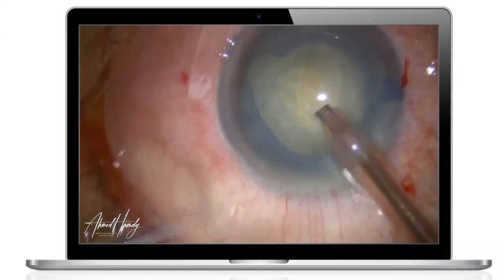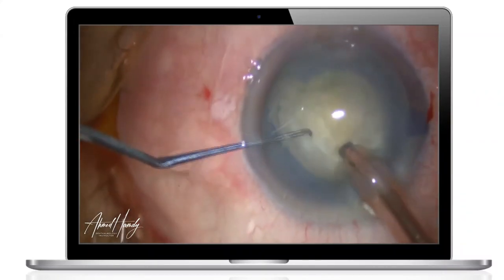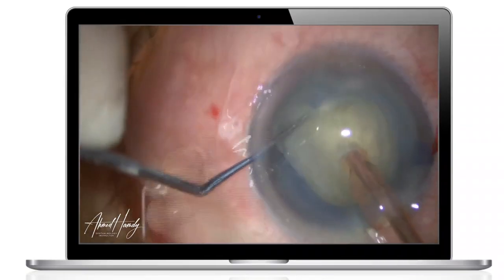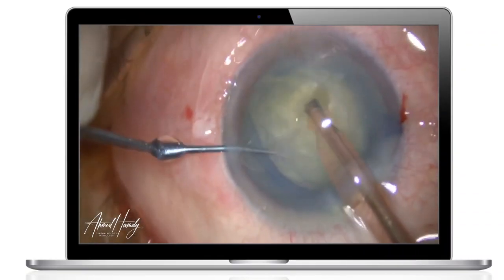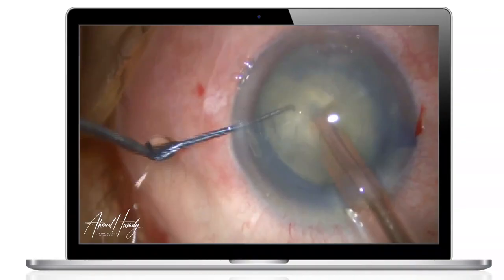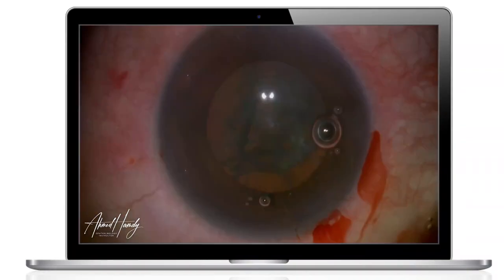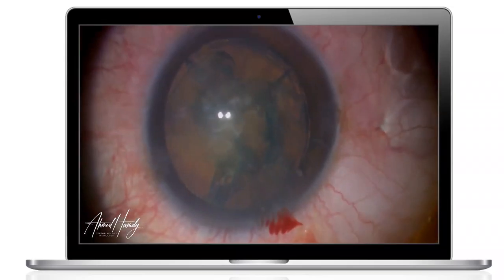So here is a vertical chopping. If I didn't explain the difference between the vertical and horizontal chopping, let me try to explain more about the difference between the horizontal and the vertical chopping.